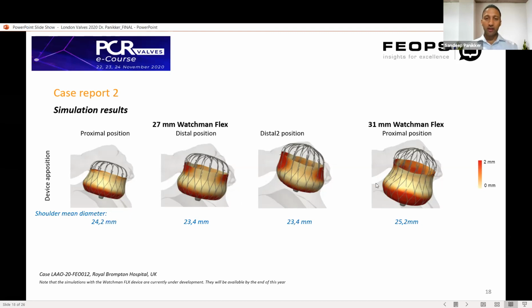Within this, there was one important part: this patient had symptomatic atrial fibrillation. So we actually did an ablation on him very early on, after he had restarted his dabigatran. And then after that, we implanted the device. The reason that was important was that I did not want too much of an overhang out of the appendage. So an amulet would not be suitable because of the large disc that closes the appendage. It would interact with the left superior vein and the mitral valve, and if I had to go back in again, I would not be able to do the ablation successfully.